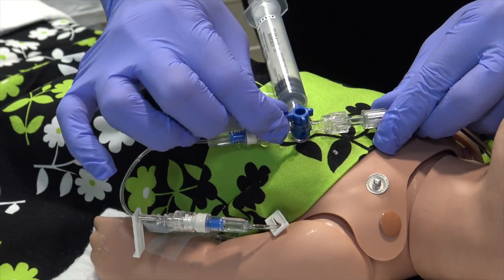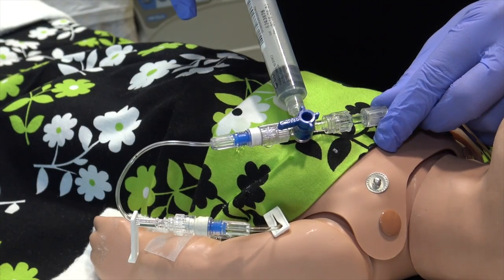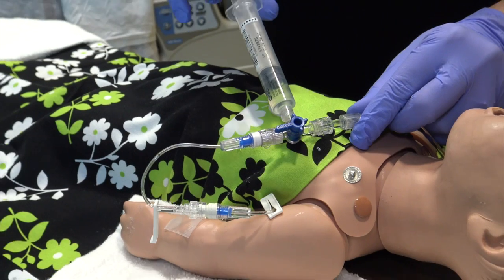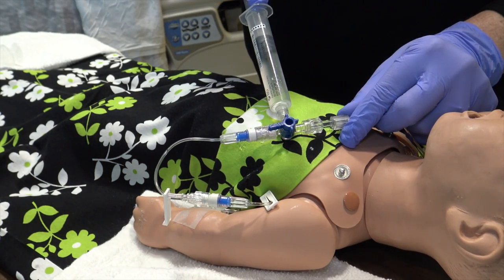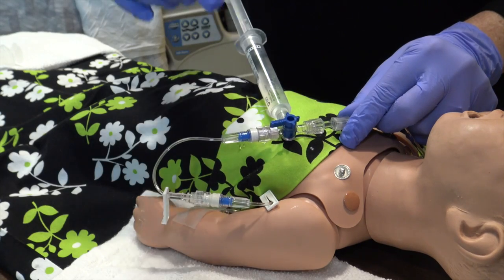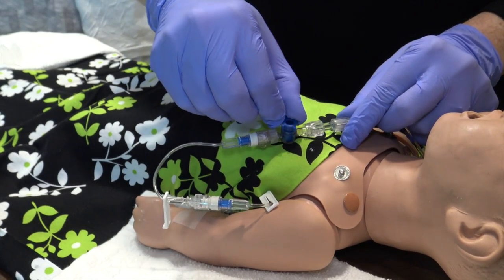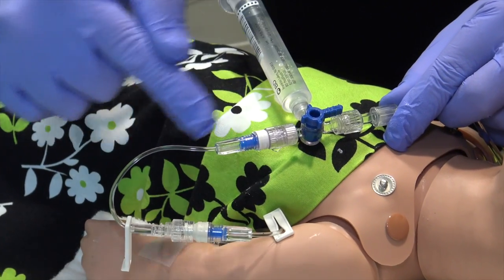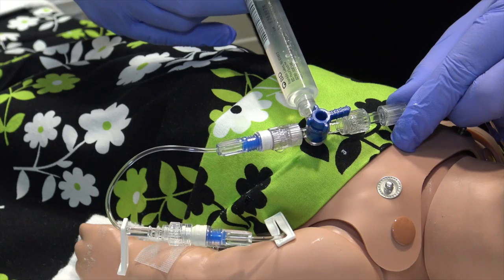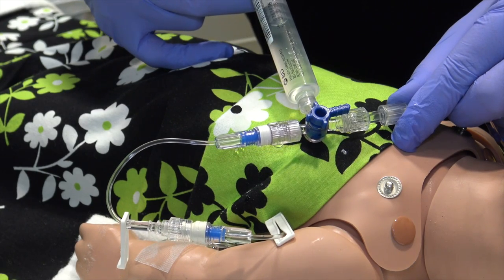So what I'm going to do is keep it turned off to my patient. I'm going to withdraw the appropriate amount of fluid. Maybe with this patient, I'm going to deliver a 10 cc bolus, so I'll pull it up to about 10 ccs. I will then turn the stop cock off to the IV line, which now opens the line from the syringe to the patient, and I can deliver my fluid bolus.